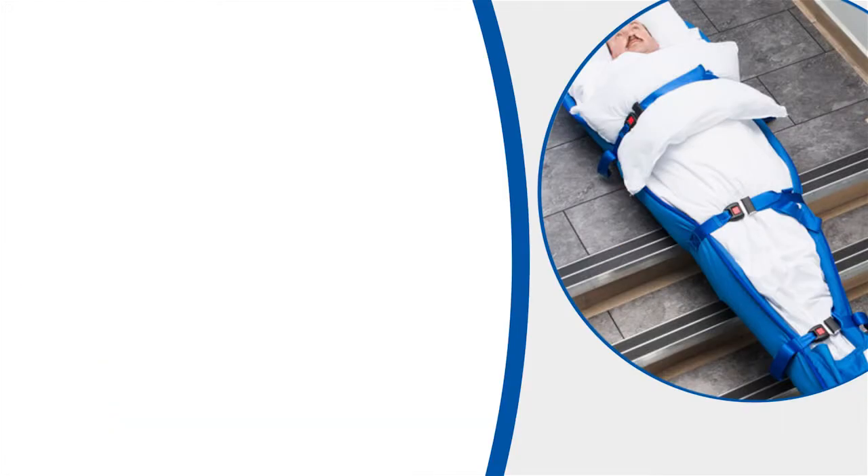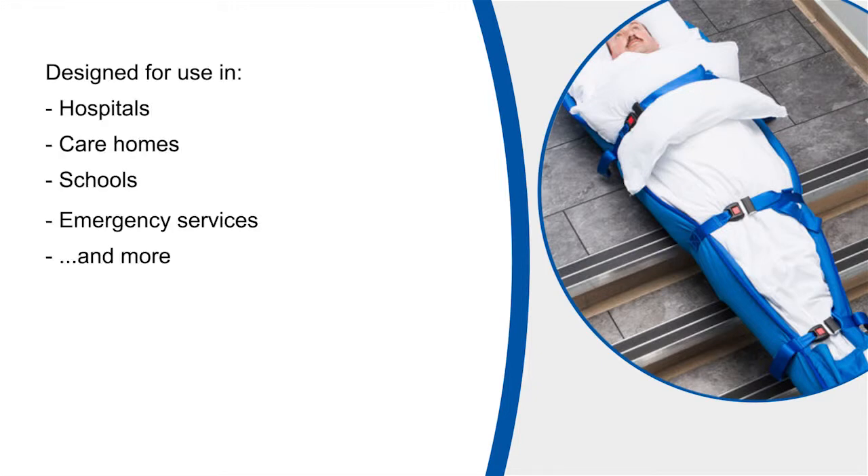Please bear in mind that although the video has been filmed within an NHS hospital, the equipment has been designed for use in various types of buildings where the available space is often very limited. Any manual handling techniques used within the video are merely suggested methods to move non-ambulant persons in an emergency. There may be other acceptable alternative techniques depending upon the physical and mental condition of the patient or resident, or within slightly different environments to those portrayed.